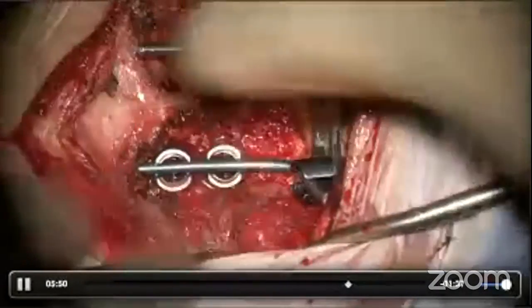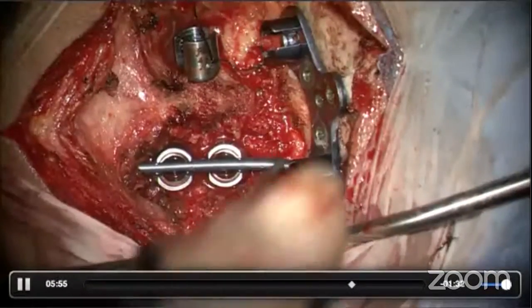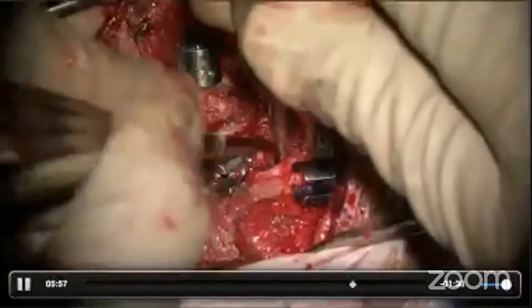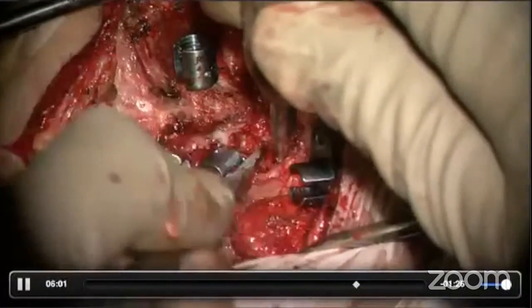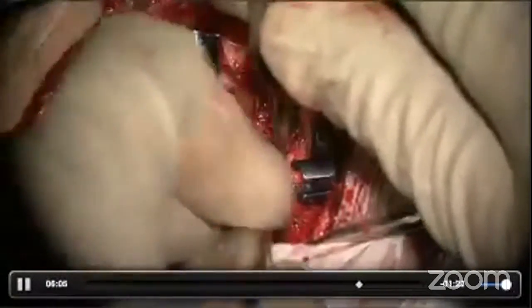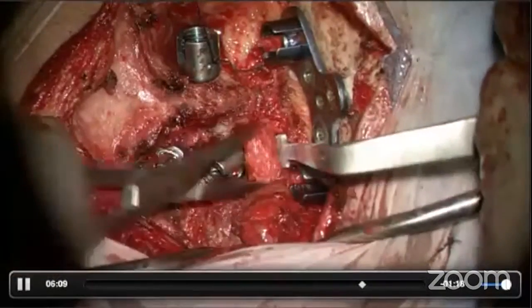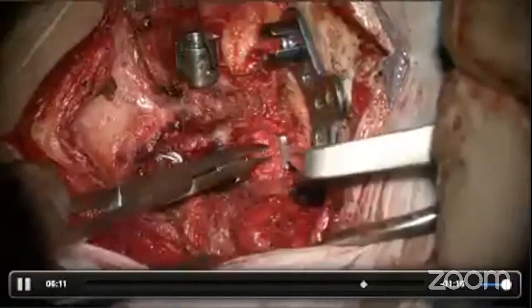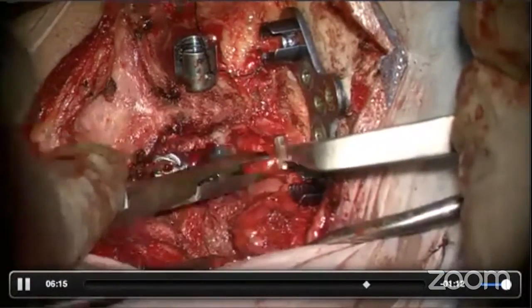Now that the rods are ready, I like to decorticate the C1-C2 joints with a curette. This is the last step before the rods are locked in, as this area can bleed considerably when disturbed like this. The joints are a crucial area where the fusion takes place. Hence this area needs meticulous attention. Autograft bone from the iliac crest is packed into the joint.